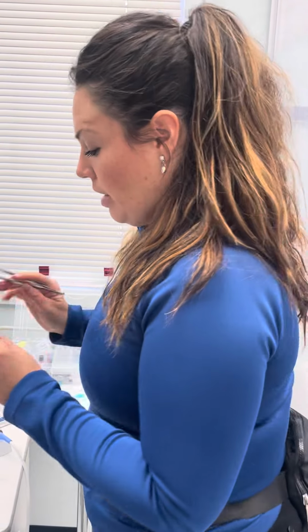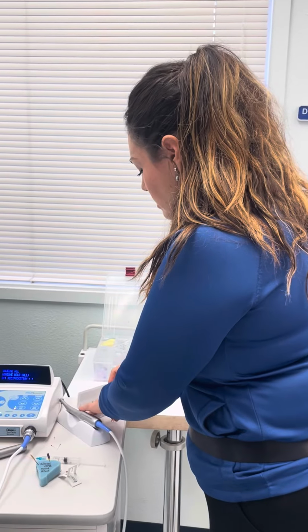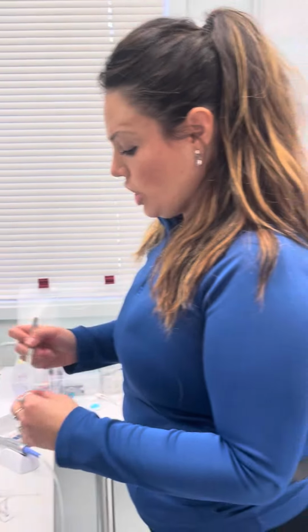Currently, how is the doctor placing the sealer? Are you putting it on a pad? Dipping the master cone? Okay, not injecting it into the tooth? Okay. Either way, it's fine. I've heard both recommendations. So at this point, you got it on the pad. We're going to go ahead and measure.